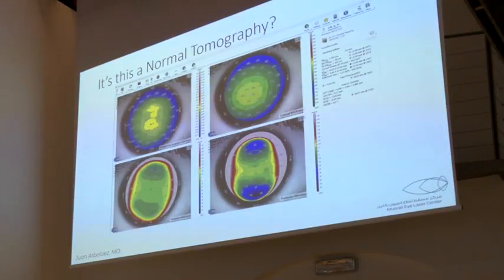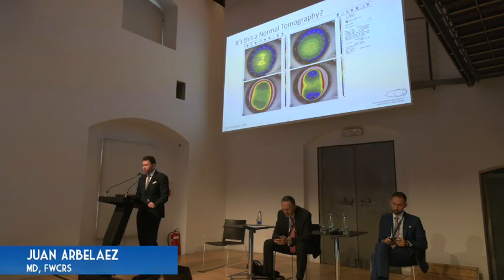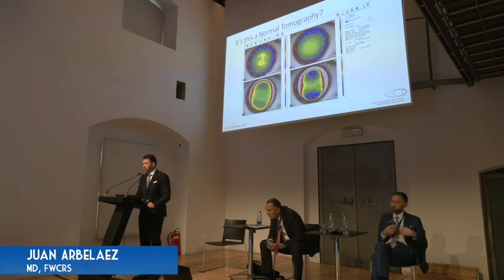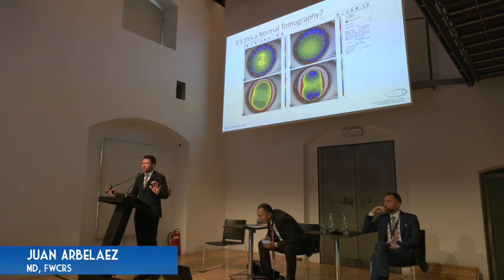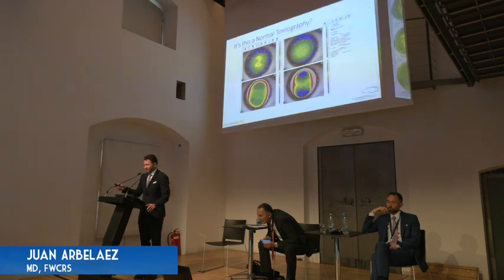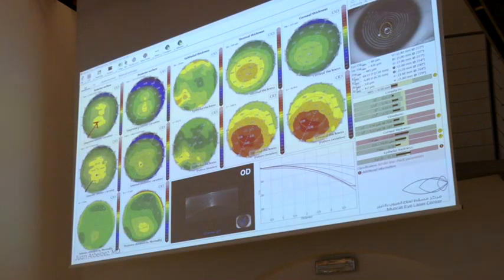It's been a couple of talks and people are a little bit tired now, so I would like you to get involved in the participation. I would like to ask you to raise your hand if you would perform LASIK or lenticule extraction on this topography. Just based on this, who will be performing LASIK? Give us the prescription, because if it's a -3, yes. We're expecting a within normal limits prescription.